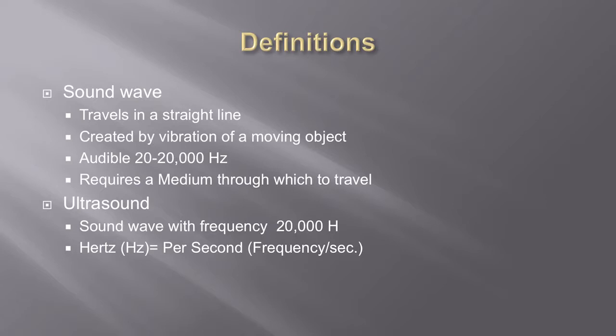Now, the biggest enemy of the ultrasound is air, so always remember that. So if you are getting a crappy image and you can't figure out why, chances are you don't have enough gel and so you're getting a lot of air between the transducer and the tissue, and that's why you're getting a bad image. So you always wanna start off there, okay? Before you start cursing, just get some more gel, plop it on the patient and then your image usually will improve.